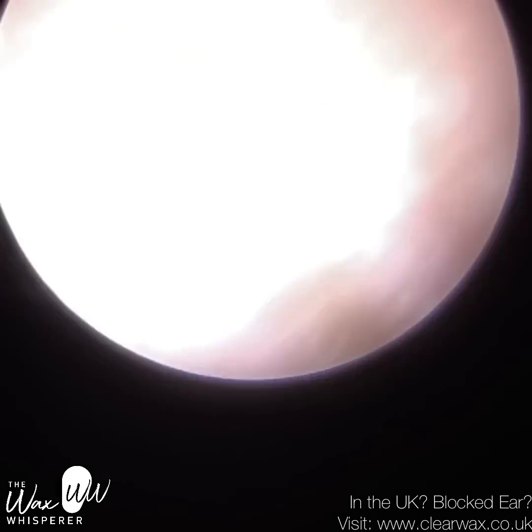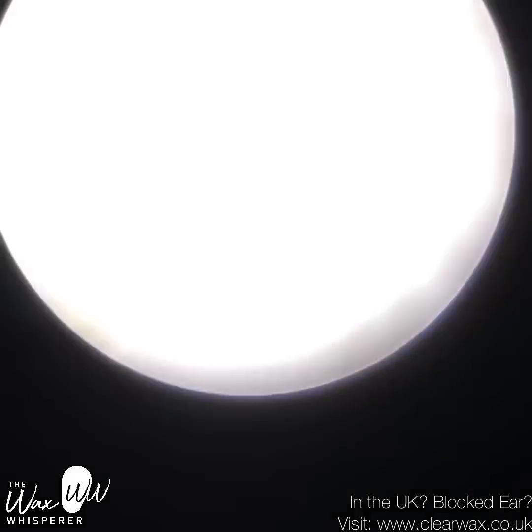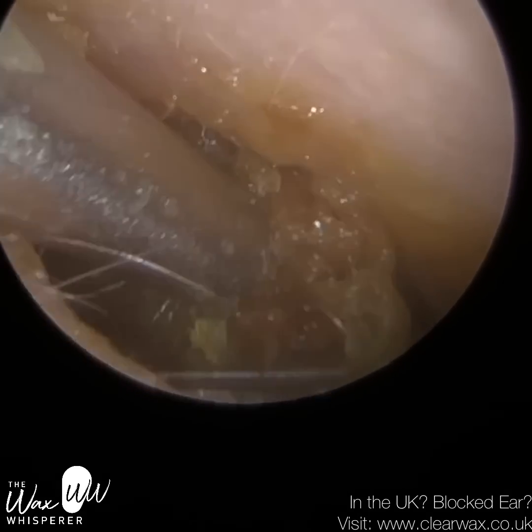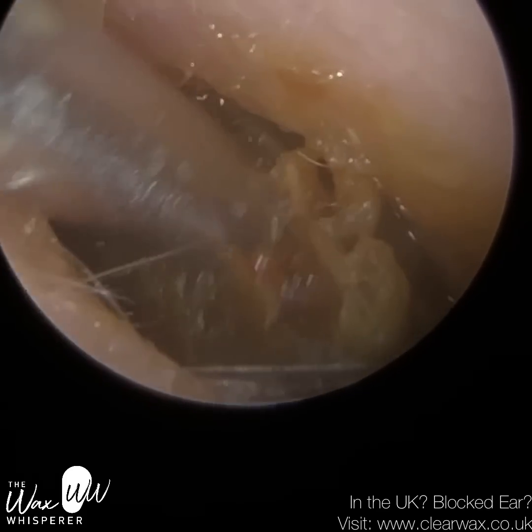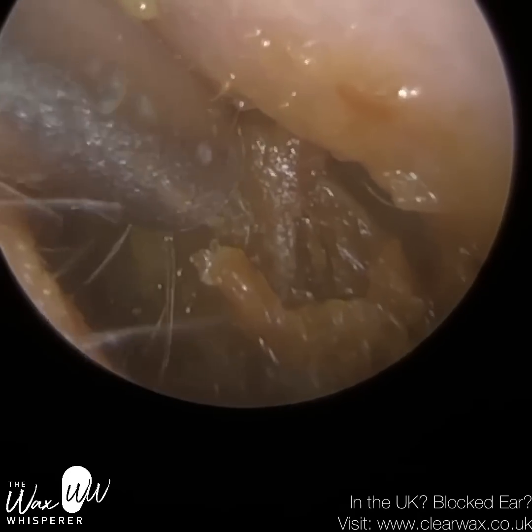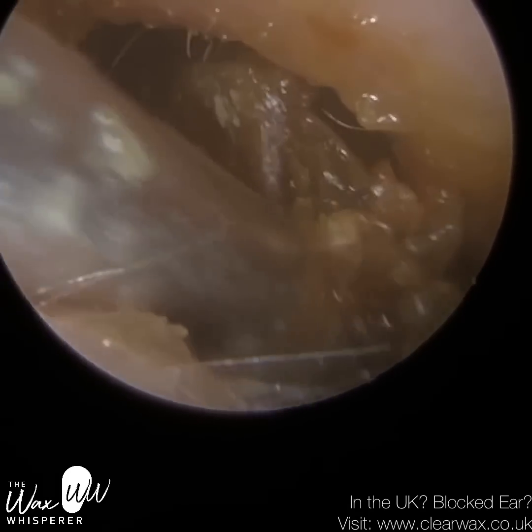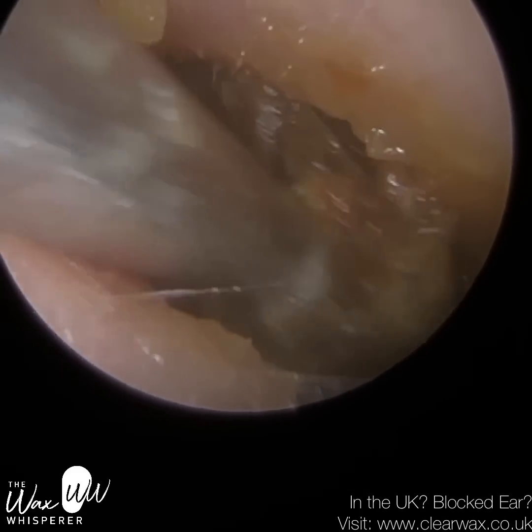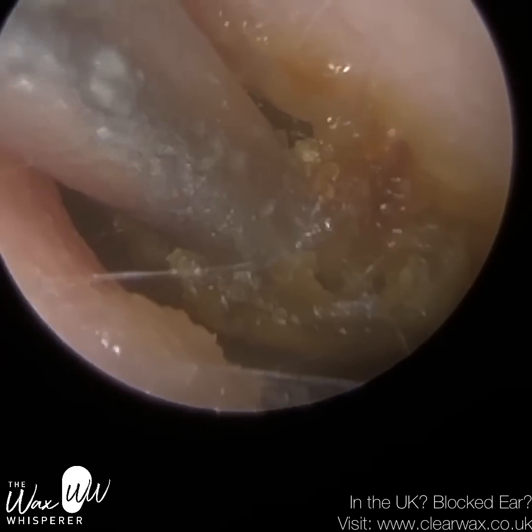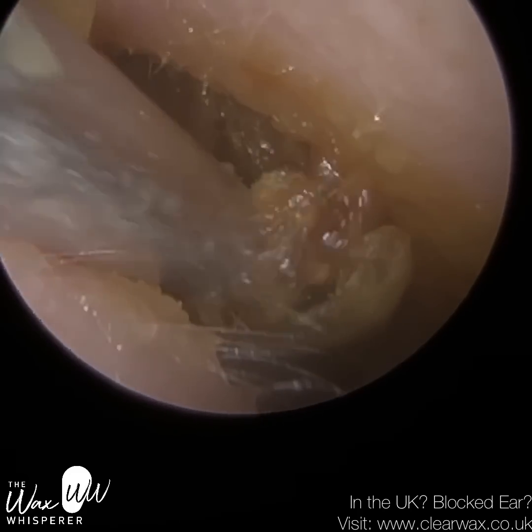Fortunately my ENT couch can either be a chair, or we can adjust it so it becomes a couch so patients can lay down. That's why the angle changes: the initial view of the ear was with the patient upright, sat in a normal seating position, and now the patient is laying down, so the angles change slightly. Once I've removed the wax, you'll visualize the eardrum more at 9 o'clock as opposed to 12 o'clock. So this plug is quite a severe impaction.